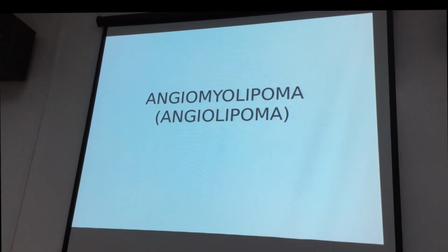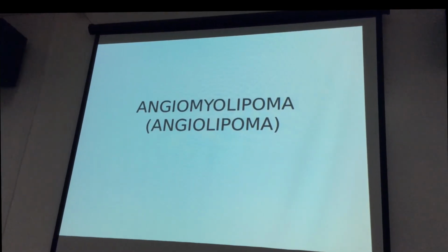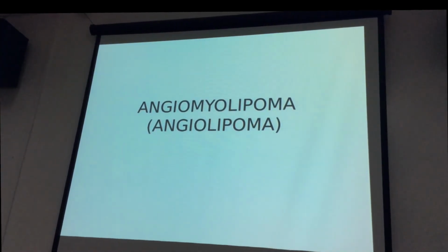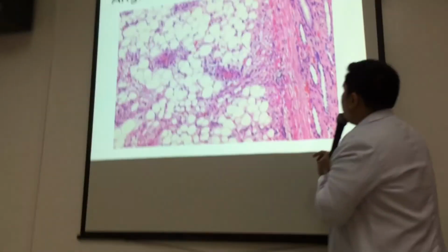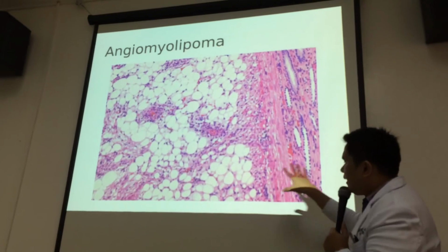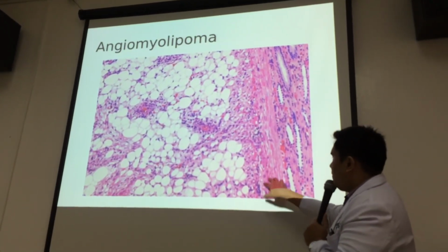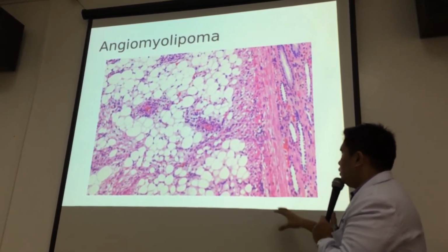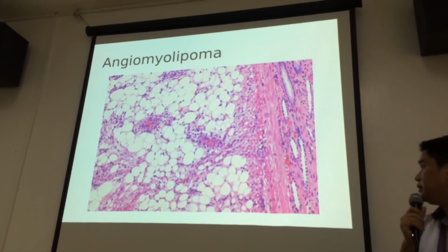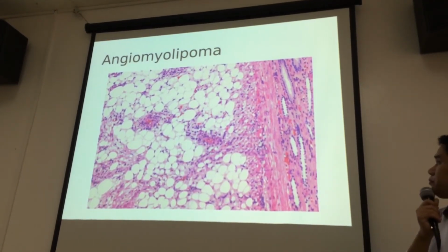So if it's angio, when there are more blood vessels, your cut surface will be bloody, at the same time reddish. If it's myo or lipomatous, you will have a yellow muscle part. Now this is again, just like your renal cell carcinoma, this will also appear as it were encapsulated, but this is actually pseudo encapsulation. These are atrophied renal tubules.